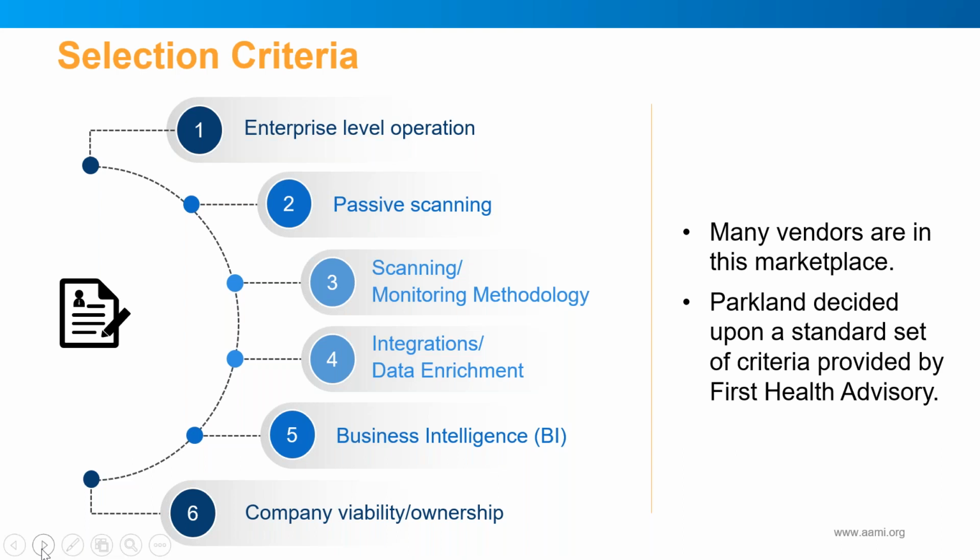And I'm not going to read each one of these on the slide, but I did want to focus in on three of them. And the first one is passive scanning. Passive scanning is pretty critical because, as most of you know, being from a clinical engineering background, as cybersecurity has started rolling out for these devices and become more of a concern, any kind of active scan or probing of some medical devices, they are so sensitive that it could knock them offline. And so the last thing you want is to be implementing a bunch of new tools whose whole job seems to be contradictory to keeping these devices online and taking care of patients.